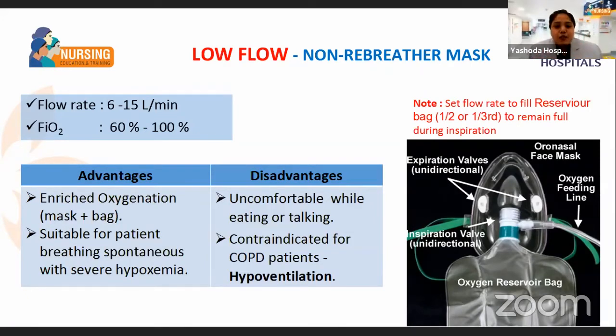That is important. And here we are supplying a good enriched oxygen for the patient, and it is really contraindicated for the COPD patients. Why is it contraindicated? May I know the answer? Yeah, already it has been displayed. So you might have noticed it's a hypoventilation.